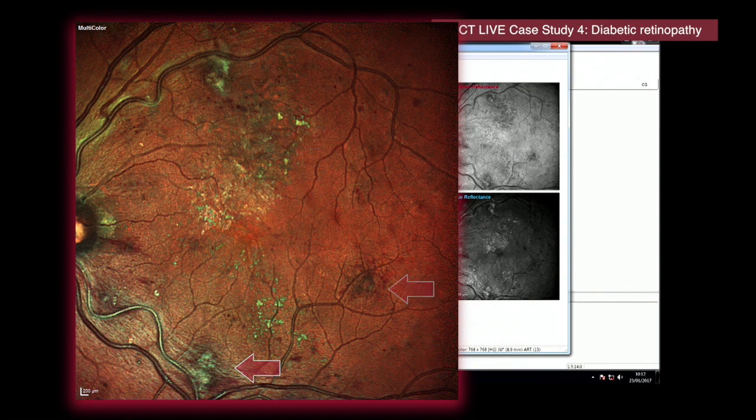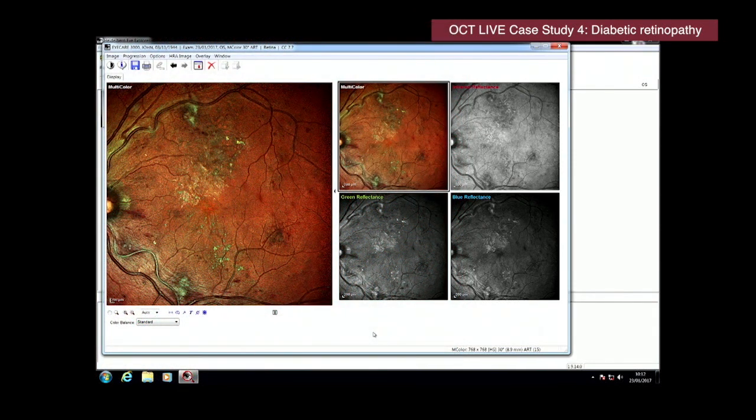Okay, because this image is a multicolour image, it requires infrared, green and blue light all simultaneously. We also will be able to pick out the areas of leakage within a colour image. And if you think about diabetic retinopathy, all the changes in diabetic retinopathy can be very simply explained by one statement. It's caused by leaking retinal capillaries or blocked retinal capillaries. Okay? And what we're seeing here is very obviously signs of leakage. Okay? So these leaking retinal capillaries break down the blood retinal barrier.